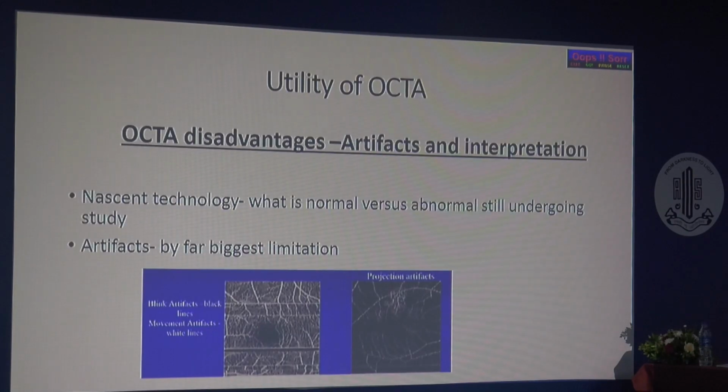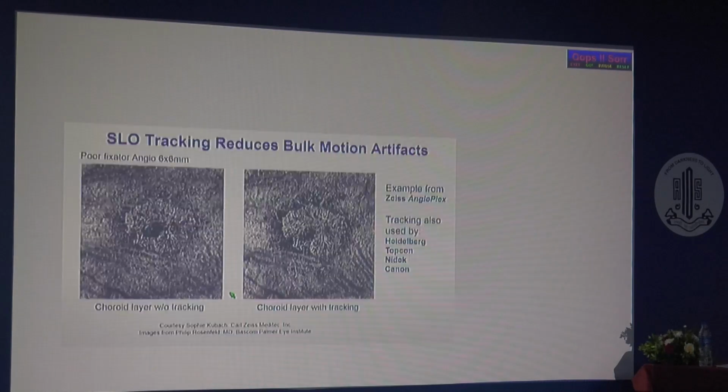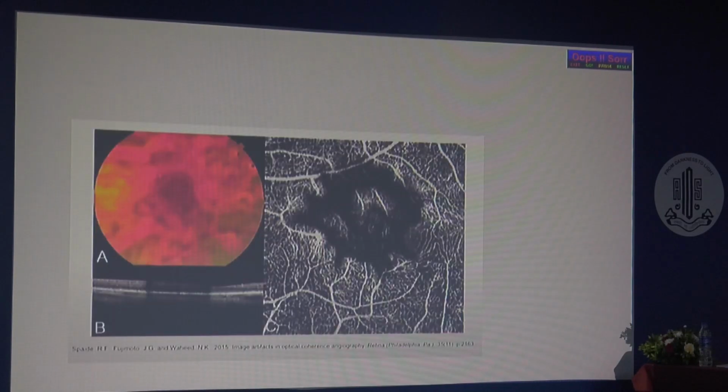So what are the disadvantages? One is motion artifact, because it takes more time than an OCT. The movement creates a motion artifact. You see these lines, right? They are the biggest problem in trying to understand an OCT angio. And the tracking, if the patient is moving. The SLO systems track better. They have better penetration. And if you have blood, again, you cannot see the CNVM properly.